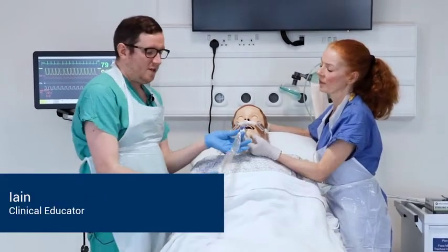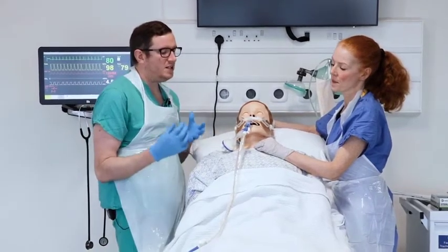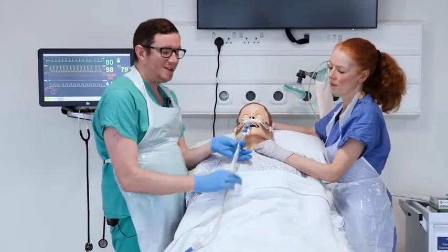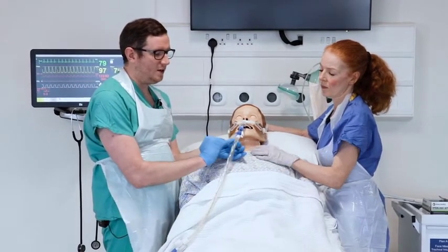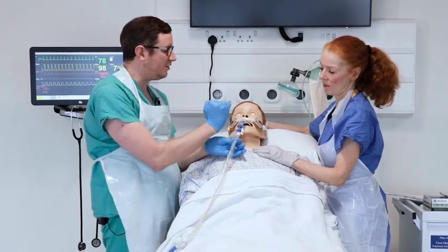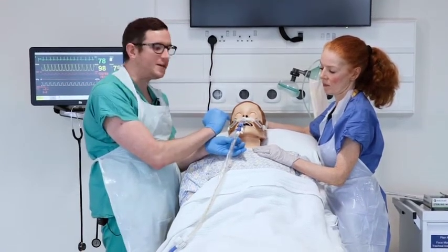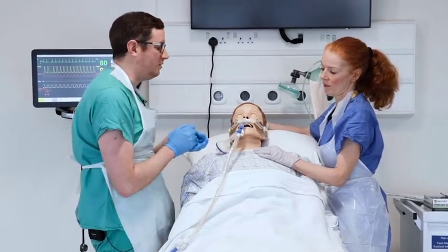We have a closed unit here, so I don't need as many concerns about ANTT as I would with an open suction unit because this has a layer of plastic over the top. One thing to note about this suction catheter is that there is a black mark at the top, which ensures the catheter is going in the correct direction before you suction and that it has fully returned when you withdraw.